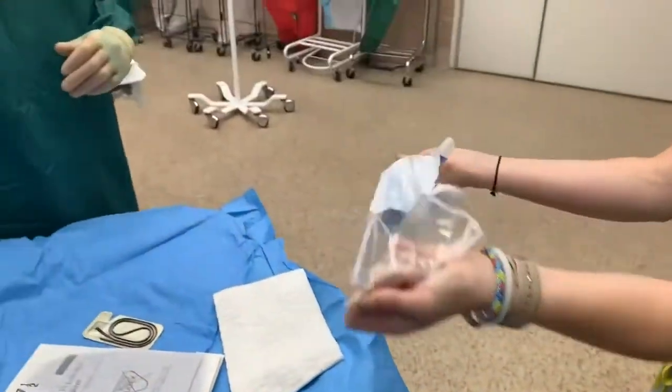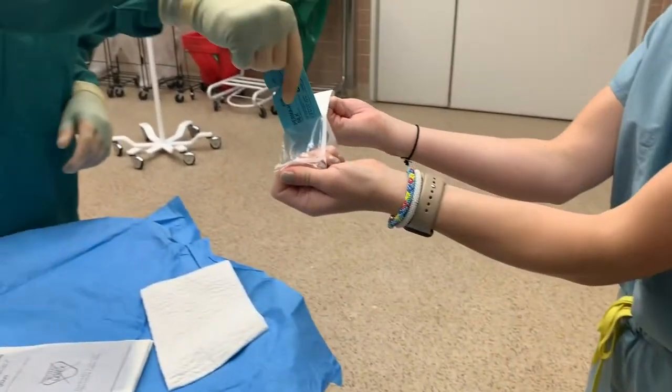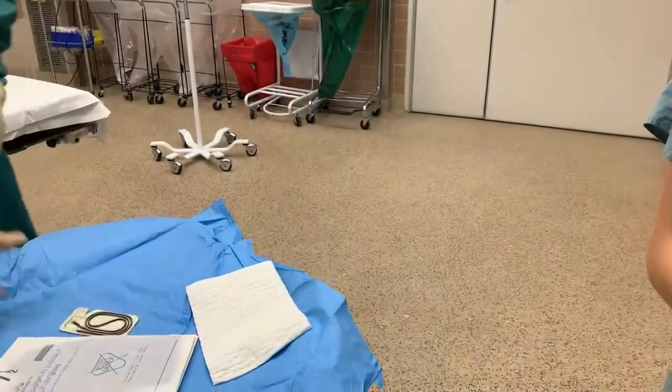You can then hand your gloves to the scrub tech. Use this technique when opening similar packaging. Make sure there is enough space between your hands and the scrub tech when handing off packages.